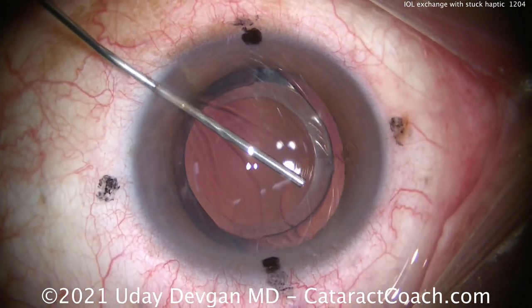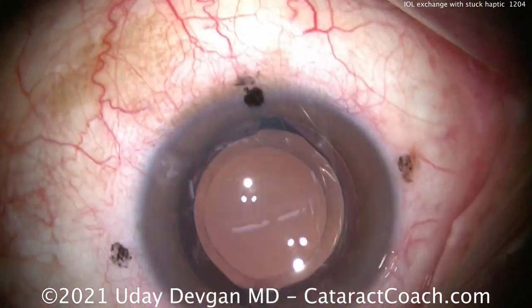We're showing you the whole video today at twice normal speed so we can get through the whole case.